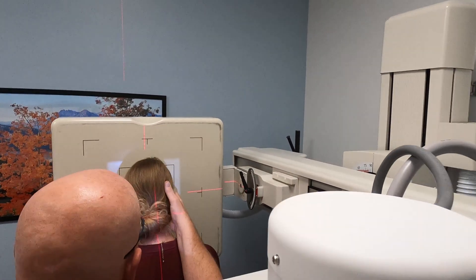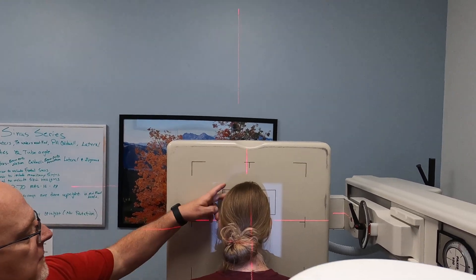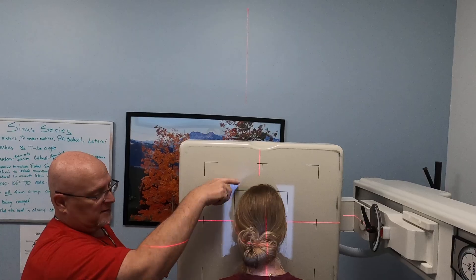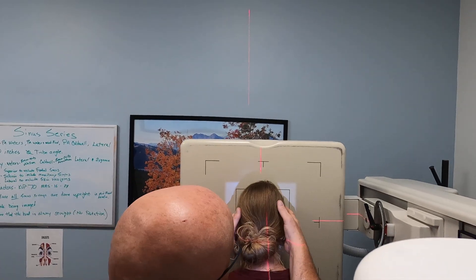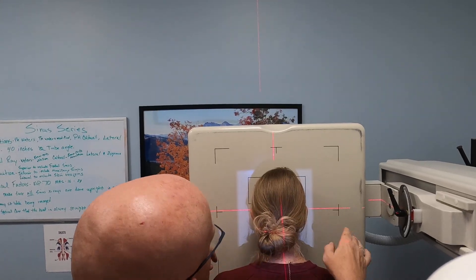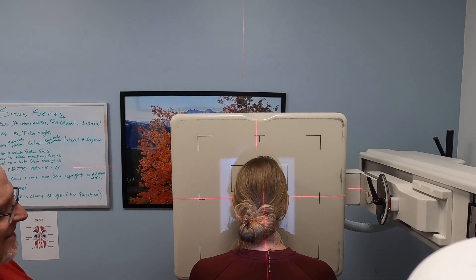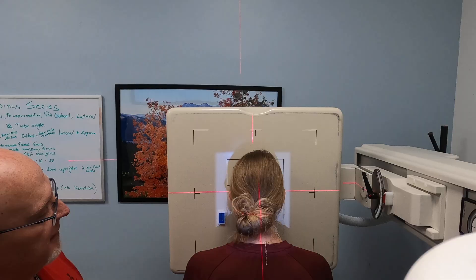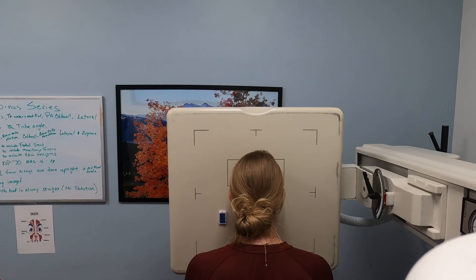Make sure the head is straight — we don't want them off in any way. Collimation wise, we want to make sure we're including the frontal sinus and the maxillary sinus. So if we've got light above the frontal sinuses and we're down around the chin, we're in good shape. We've collimated as tightly as we want. We're open on the sides and open to the frontal and the maxillary sinuses. We're going to mark this on the left because this is Kate's left side. We're going to shoot this on suspended breathing at 70 at 20 — and there's your Caldwell.